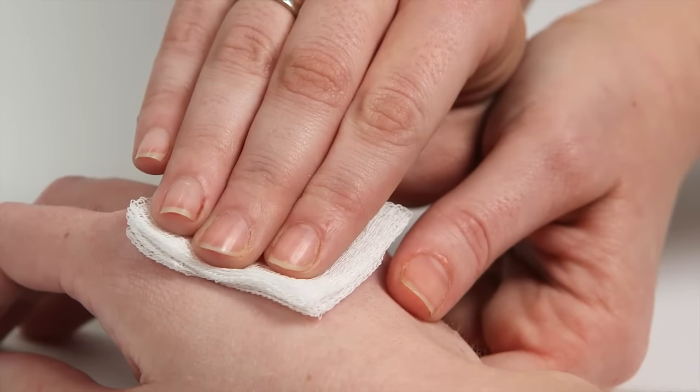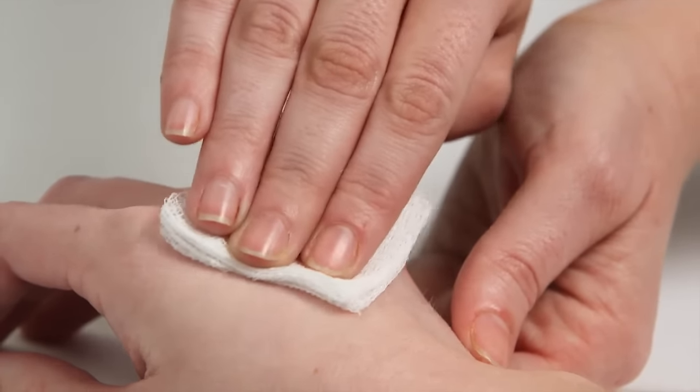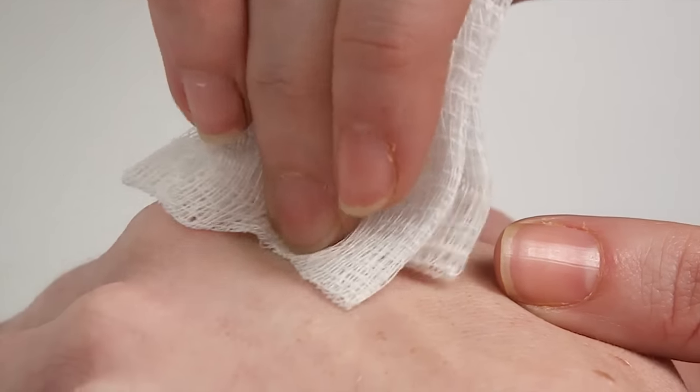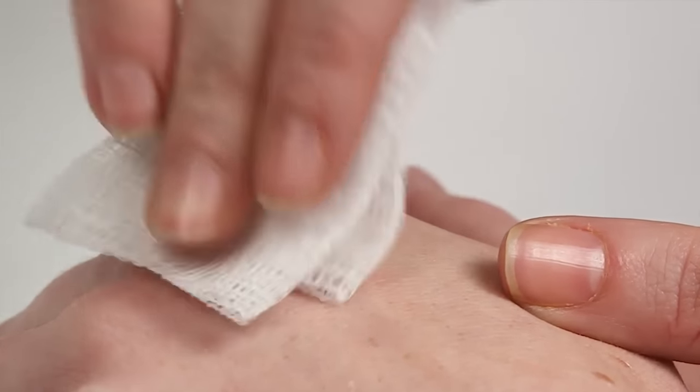After the procedure, you may notice a blood reflux or skin wheal at the site of the injection. In areas where there is a lack of subcutaneous tissue, some medication may spill out. Simply wipe any excess medication from the skin. You can also apply light pressure in a circular motion at the injection site to help disperse the medication. If the injection site was near a vein, you can also wipe in the direction of the vein to help assist medication dispersion.